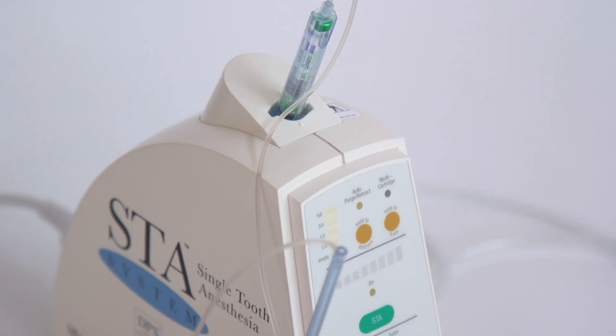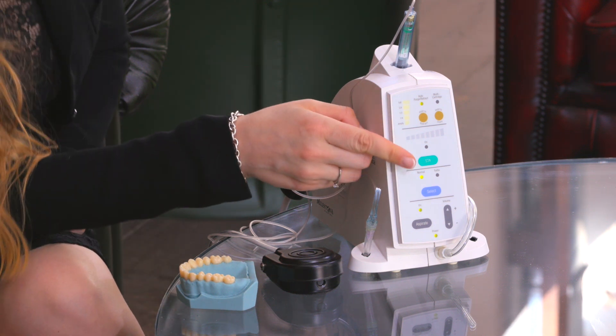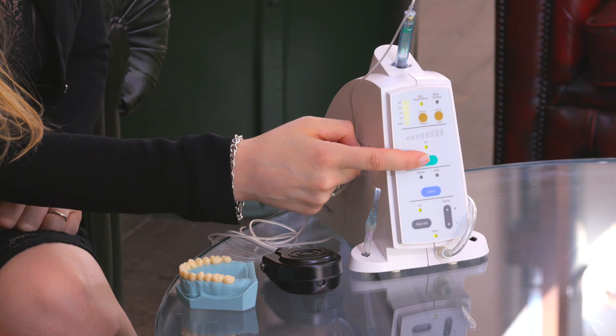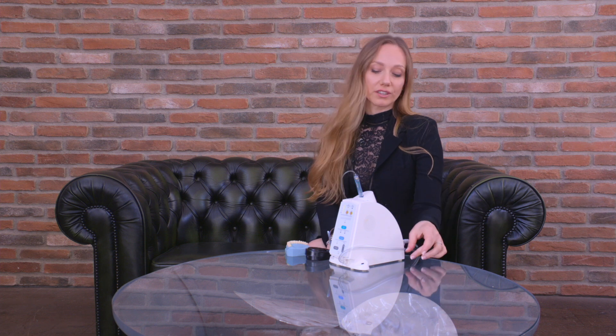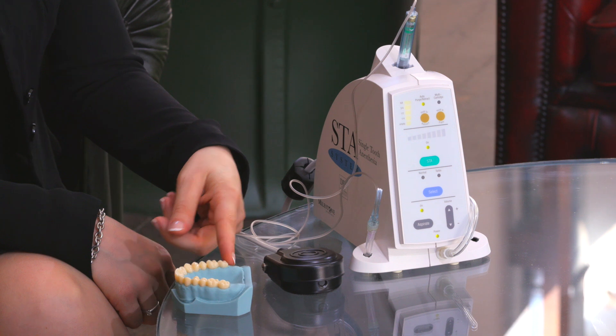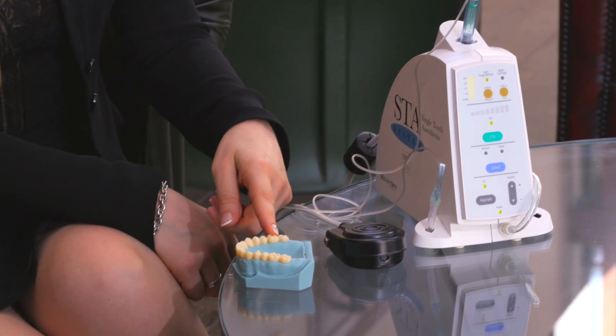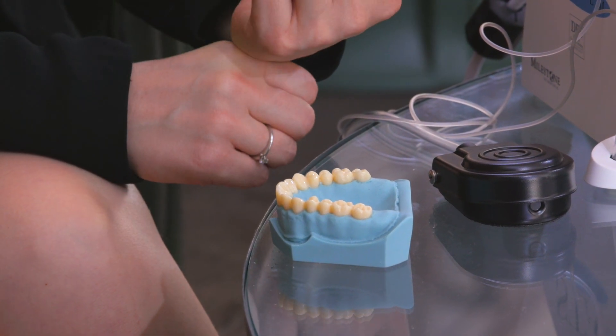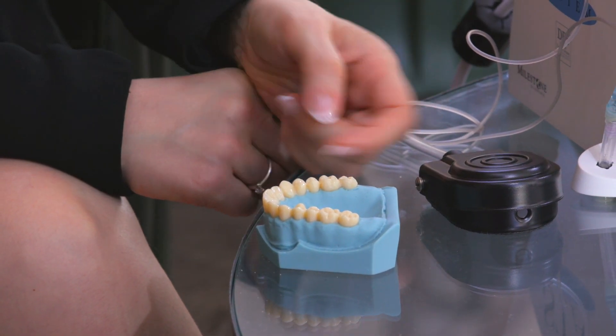To provide a single tooth anesthesia, you have to select the STA mode, like here. And you always have to consider the tooth you want anesthetized. Because for multi-rooted teeth, you have to select two injection points — one distal, one mesial. For single rooted teeth, you just have to pick one point, which is usually distal.